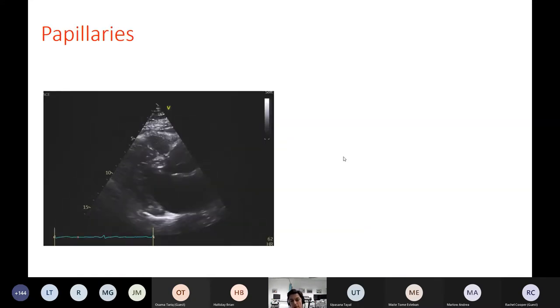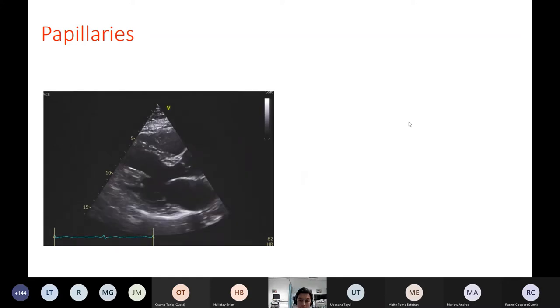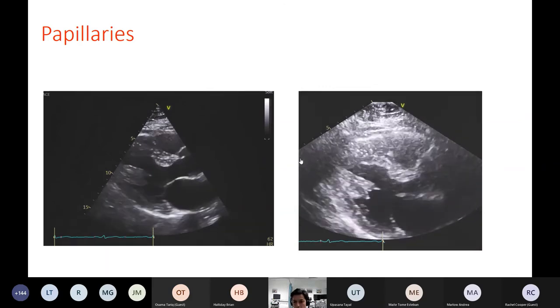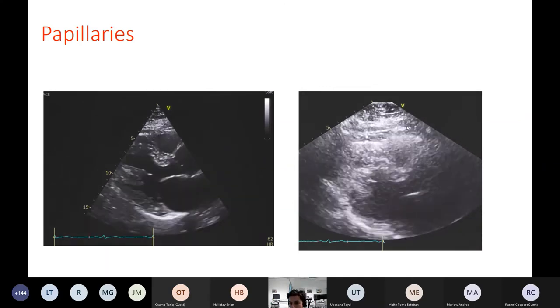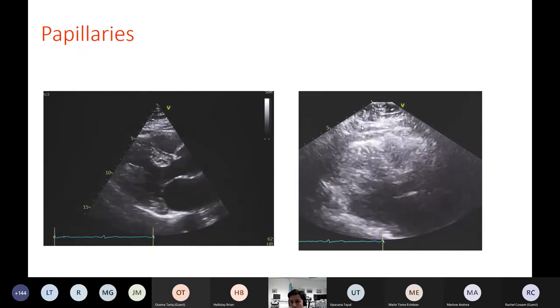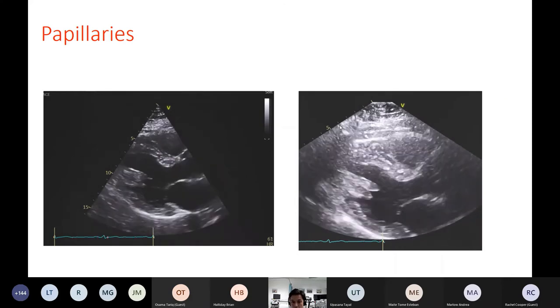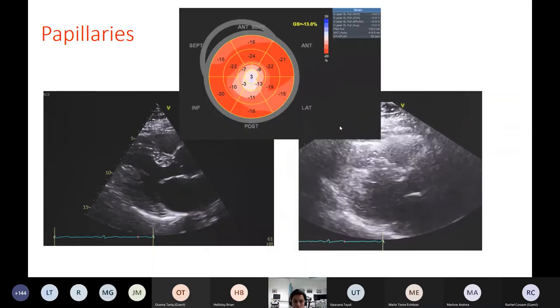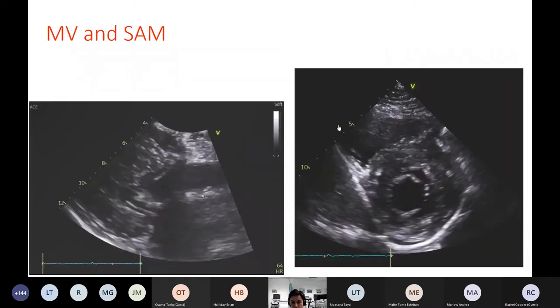So that brings us to mini echo snack number three. Often the most notable abnormality is often noticed first in the papillary muscle, like the case two cases ago, particularly if it's hypertrophied and extending to the apex. So we can see this one looks quite suspicious here. And if we go down a rib space, we can actually get an answer straight from the second image. And in this case, we can see the extent of the papillary muscle hypertrophy and even apical hypertrophy. And of course, a strain map to confirm this as apical hypertrophy.